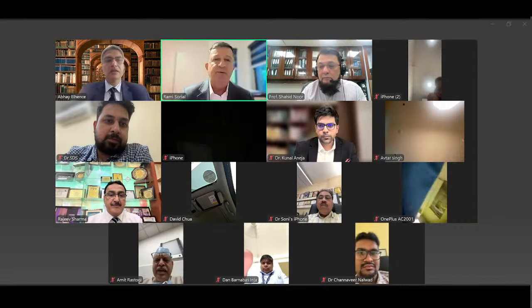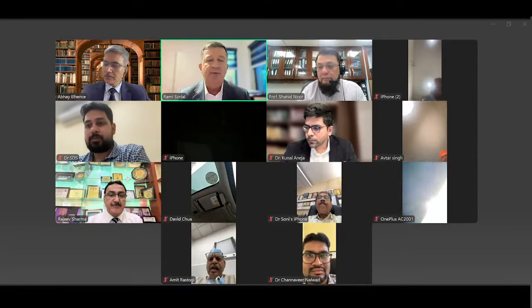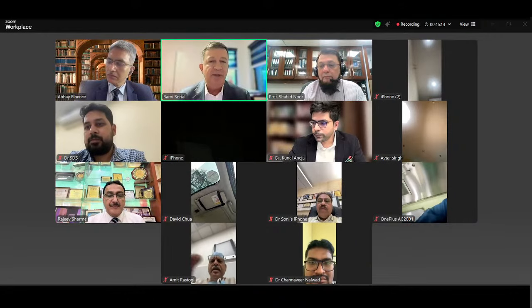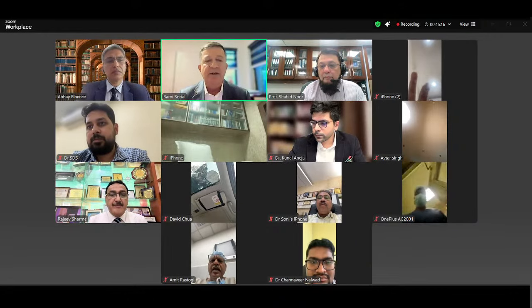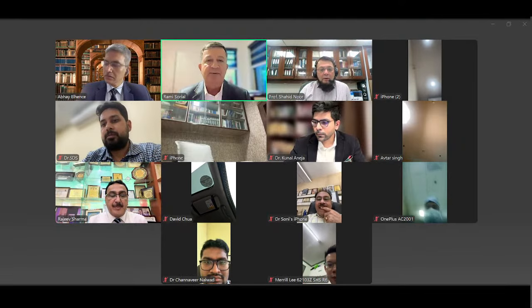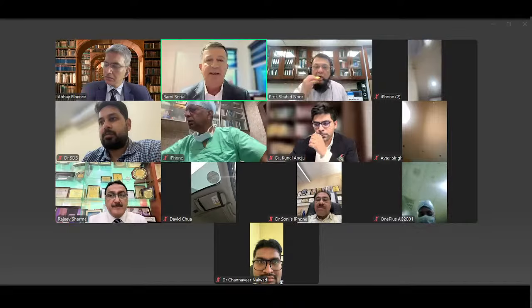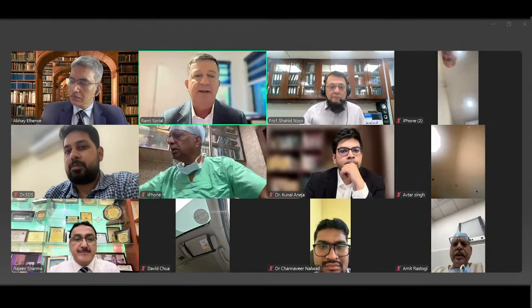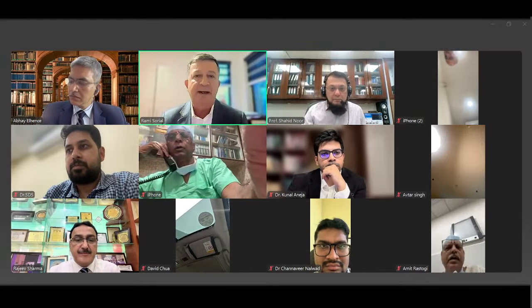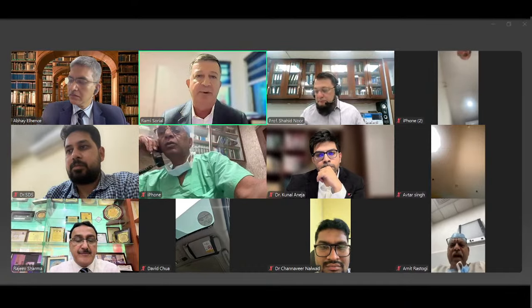So what I showed is 3 versions of a software program from different companies. So no doubt this will develop and evolve, and there'll be versions in every country, maybe locally developed, that deliver the same outcome. I've got to emphasize, I don't use robotics for hip replacement. So what I demonstrated there was patient-specific instruments that can be 3D printed in your own office if you want to, and have them available and connect them to a simple laser that can be bought anywhere. So it's a much cheaper way, if you don't have access to robotics, to deliver a satisfactory outcome in terms of positioning of your acetabular component and the PSI for appropriate neck osteotomy cut.